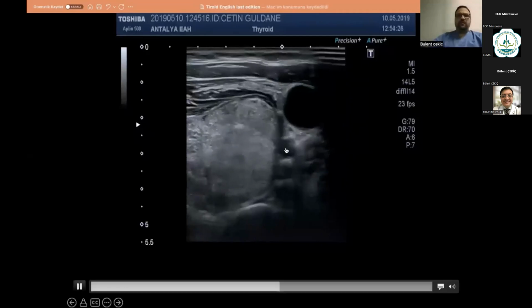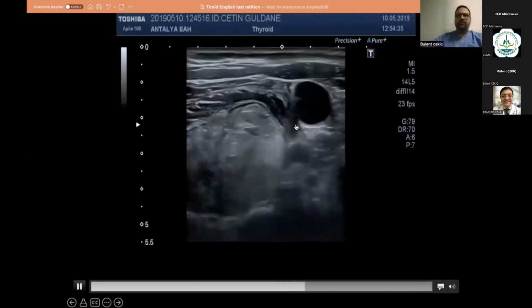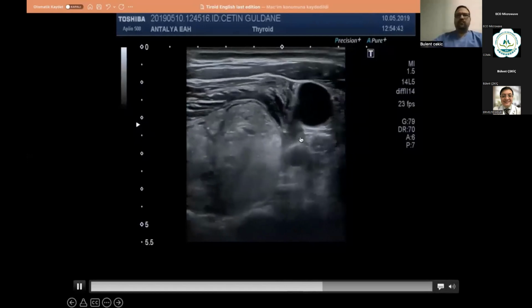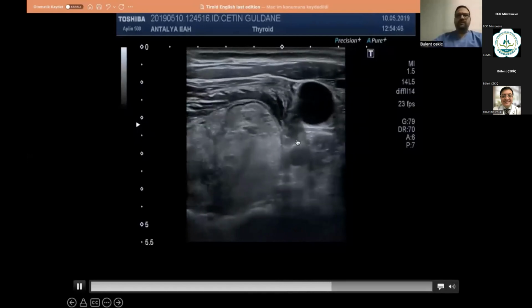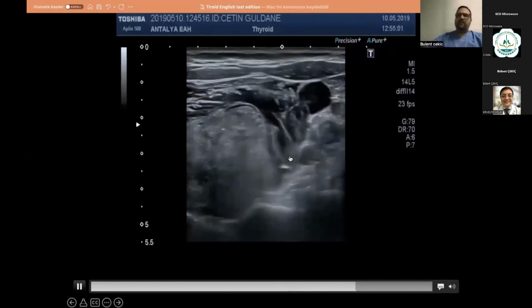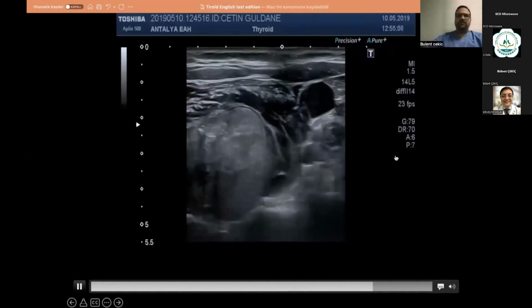And then the carotid artery is close to the thyroid nodule, and we use a perpendicular approach, and then we navigate the needle, and then we give here, for example, 20 cc cold dextrose, and then we have a safe area for doing hydrodissection.